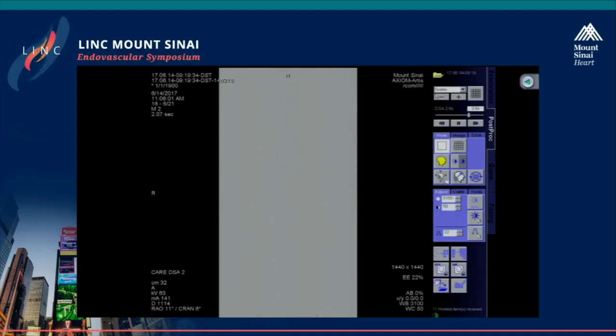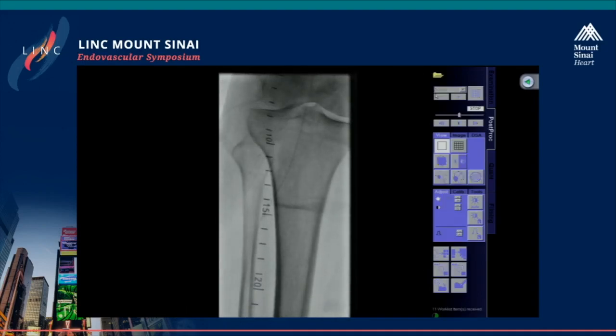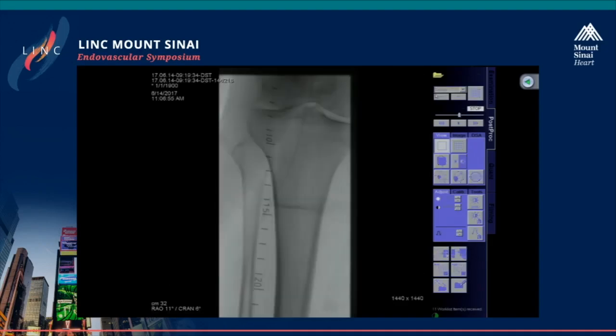Okay. So as far as DCB sizing, what size DCB would you choose? What diameter did you measure in the IVUS? The IVUS, the distal was 3.5, proximal was 4. And you can see that we have a little bit of, I'd say, plaque shift into the proximal, which I'm going to have to balloon or stent or do further atherectomy. So I'm going to do further atherectomy distally into the AT. But I'm curious what type of DCB you would choose. Can we see the bifurcation again of the tibialis anterior? Right here. Because it is not so clear for me. I agree, sir. Inject.